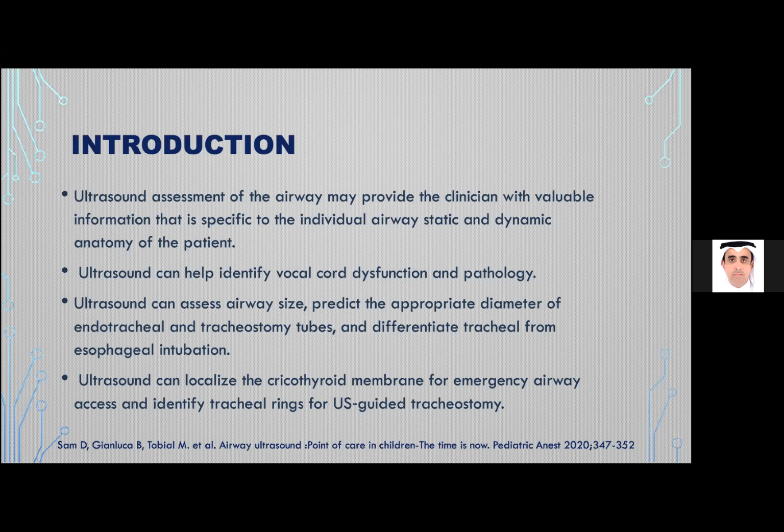After finishing this, you can make another cut of scanning for this patient by keeping the probe under the mandible, with the indicator more anterior. You can ask the patient to tilt and rotate the head to the other side, and you will visualize the tonsil. This is the tonsil, and it is easy to see if there is any abscess or any enlargement in size, and to predict it.